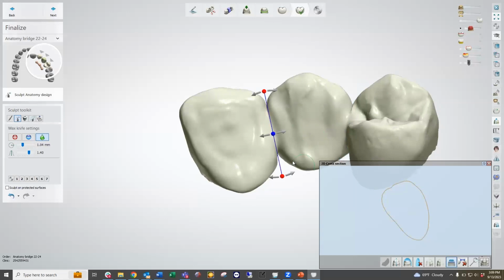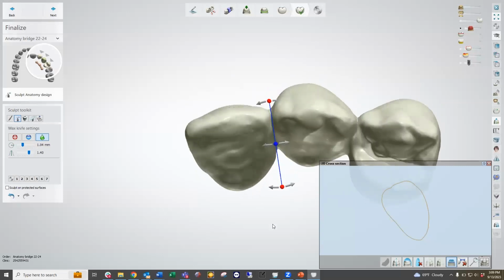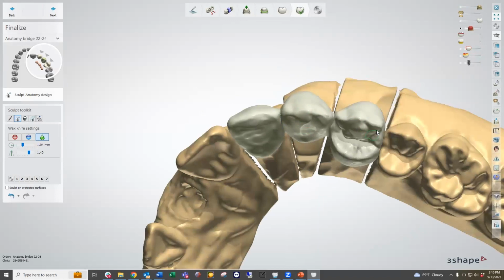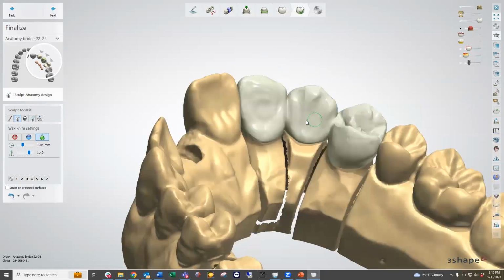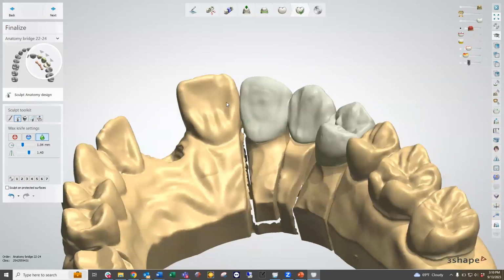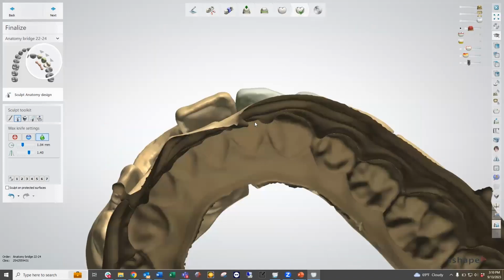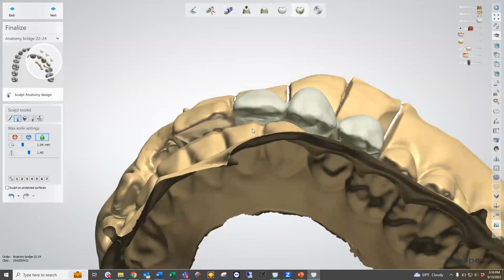So yep, we have 12 millimeters squared between our interproximals on our lateral and cuspid, and we also have 12 millimeters squared on our cuspid and bicuspid as well. So functionality, this bridge is going to be good. We have nice solidified connectors interproximally between these units, and it fits snugly between the units that we have neighboring it as well. And we know that we have that one issue on the occlusion, but otherwise everything looks good. So we have a nice, well-designed bridge, and that's basically all we have to do.